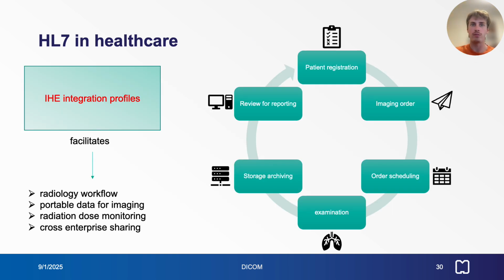IHE defines integration profiles to address specific use cases, enabling seamless interoperability between devices and systems using standards like DICOM and HL7. These profiles eliminate uncertainty for implementers and purchasers by defining actors and transactions, such as scheduled workflows for radiology, portable data for imaging, and radiation exposure monitoring. Originally focused on enterprise-level workflows, IHE now also supports cross-enterprise document sharing to enable secure and efficient interoperability across healthcare organizations.